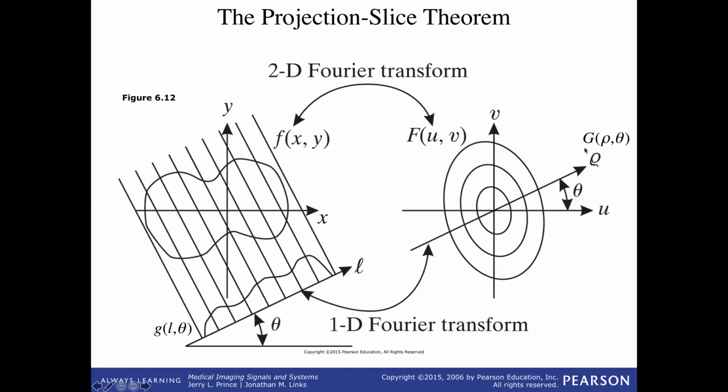Here, oh yeah, this is the sample of the Fourier transform as a function of rho at the angle theta. Okay, so it's a sample of this guy. I guess this should actually be f at various values of rho. So that's a bit of a screw up in terms of terminology, but the reason it's capital G is because it is the Fourier transform of little g, right?